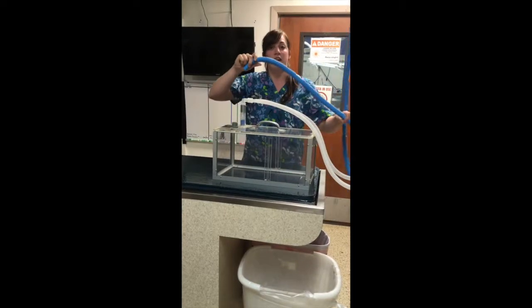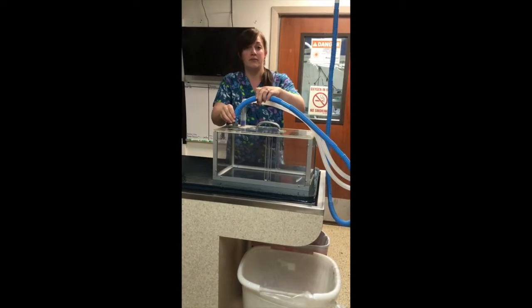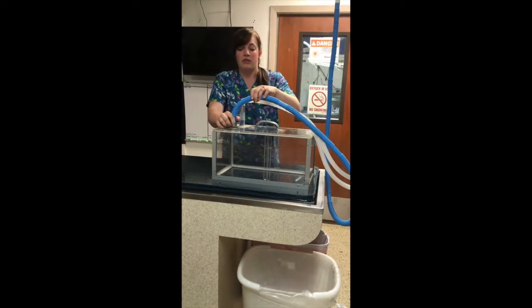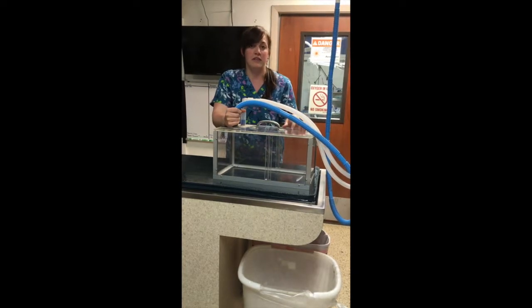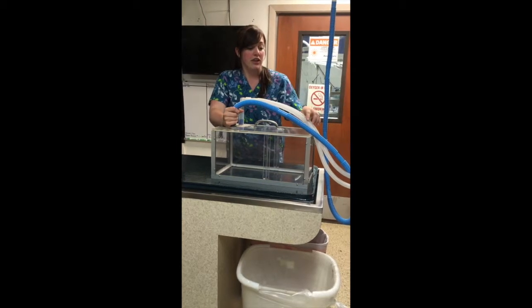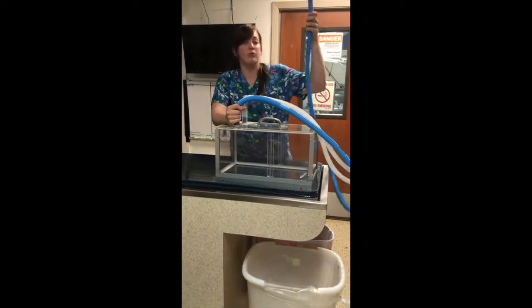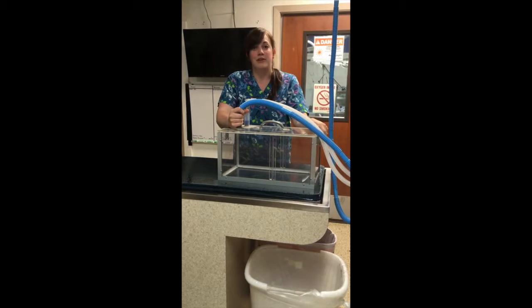Your next is where you're going to hook your scavenging system up to. And ours is broken, it doesn't fit, but this is where it would go. So imagine that that is stuck there. So all the extra gases can exit out of this, so you're not just filling this box. The extra gas has somewhere to go. So you have oxygen and anesthetic agents coming in, extra gases leaving through the scavenging system, and that is an induction chamber.